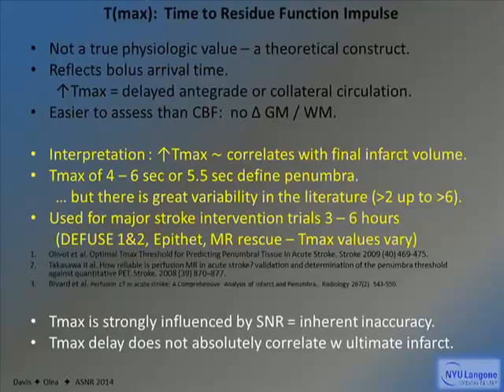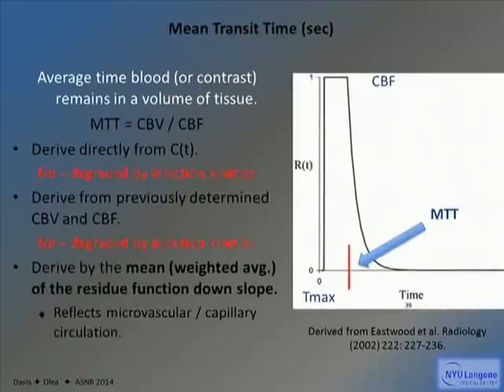Tmax is strongly influenced by signal-to-noise ratio. It is inherently an inaccurate index. And furthermore, Tmax is not an absolute indication of what will and what will not infarct.